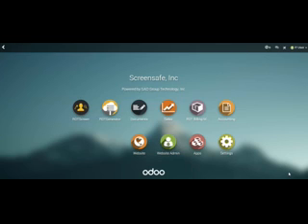This video will demonstrate a complete workflow of the new RDT screen. This is version 2 of the application and has moved from a desktop application to a browser-based application that can now be accessed from anywhere.